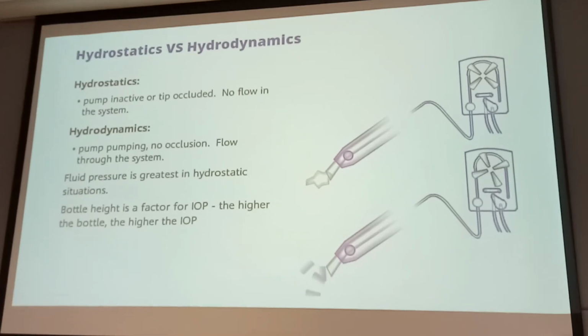Sometimes we are using different phaco tips. With different phaco tip opening sizes, the vacuum setting should be different, because the holding surface is very important. The larger the holding surface, the bigger the force the vacuum can set up. But the larger the holding surface, the lower the occlusion rate.